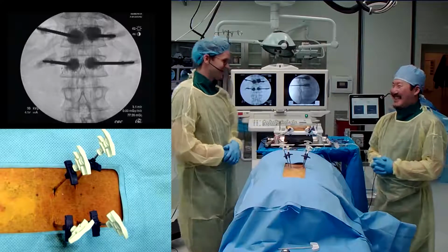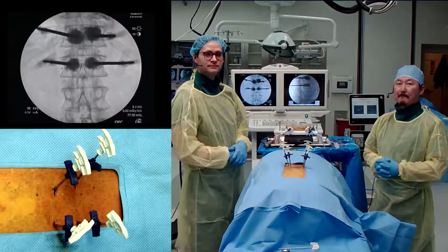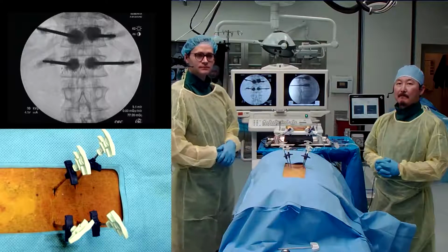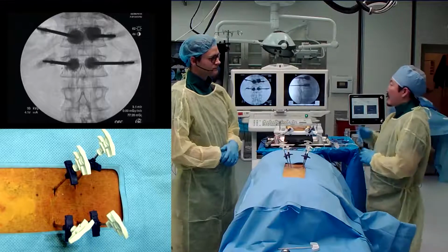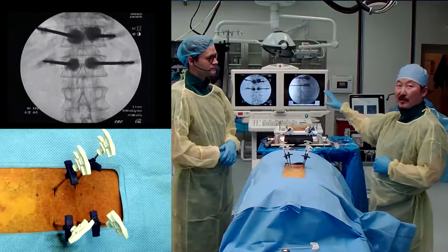One question for you, Jeff. If you're doing this and you all of a sudden see cement going where it shouldn't be, like posteriorly, can you give us some advice on what to do at that point? In all honesty, what happened here is actually a good learning point, right?